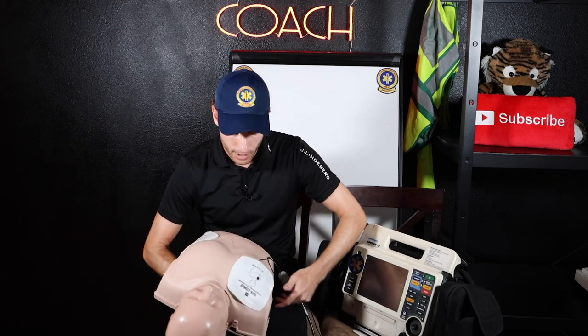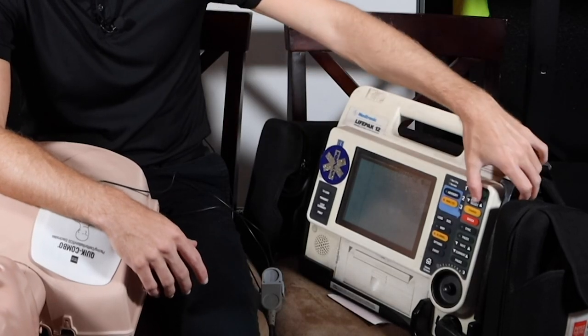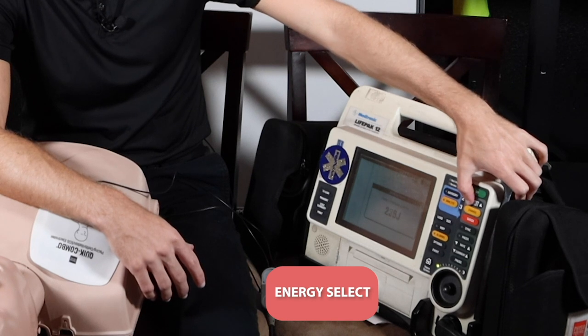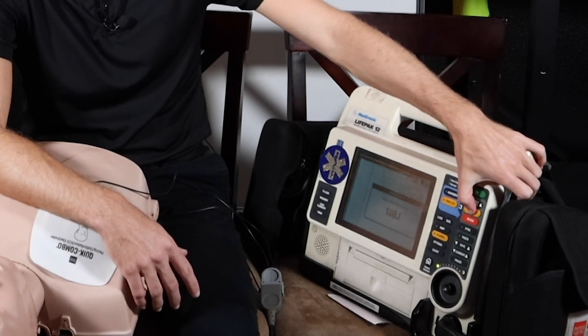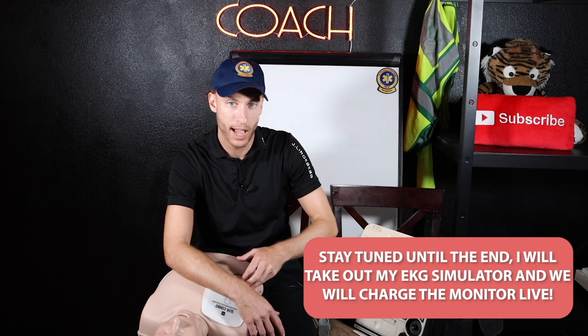Let me show you what that looks like. Now these pads are expired so it may not come up on the monitor, but I'm just going to turn it on to give you an idea. On this side here we have the energy select. We can move up and down on energy select — we can choose the energy that we want. Let's say you want to cardiovert a patient at 100 joules — we go to 100 joules, we hit charge. Now it says connect electrodes. These have been on this dummy for about half a year so it's not going to work, but if we hit charge it would charge up, and then we hit shock. I'll try by the end of this video to show you — you can hear the charging and shocking, so stay tuned for that.